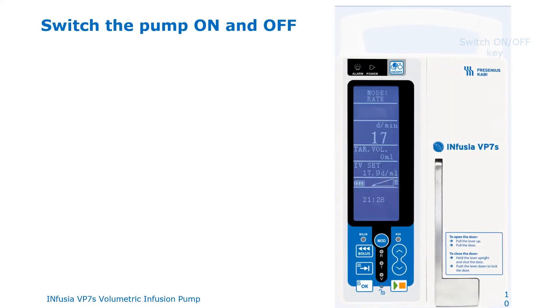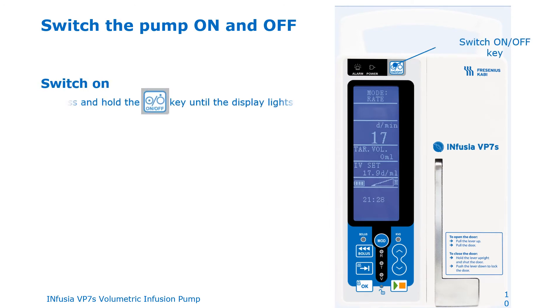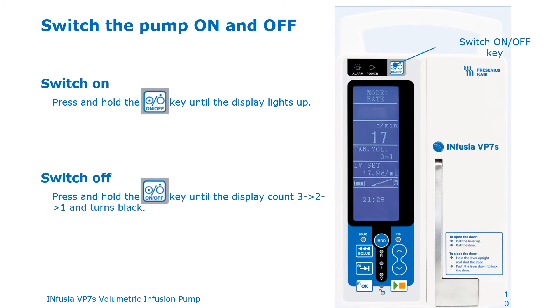Let's now see how you can switch the pump on and off. To turn the pump on, press and hold the on/off key until the display lights up. To turn the pump off, press and hold the on/off key until the display counts down three, two, one, and turns off.